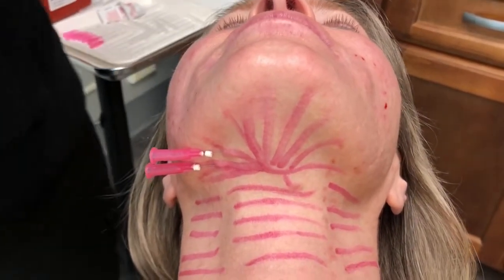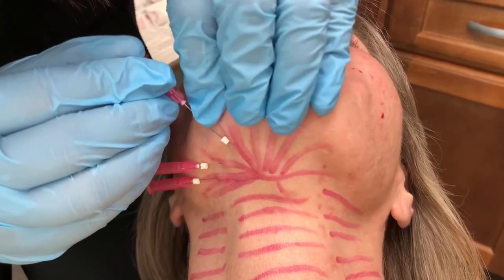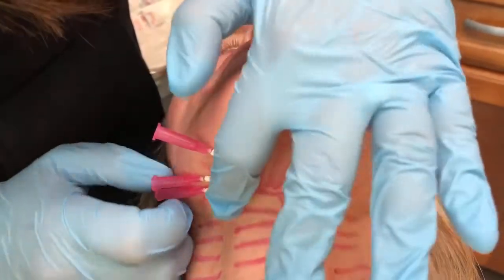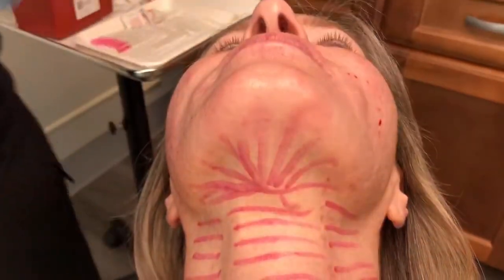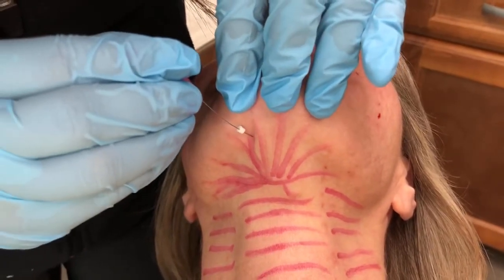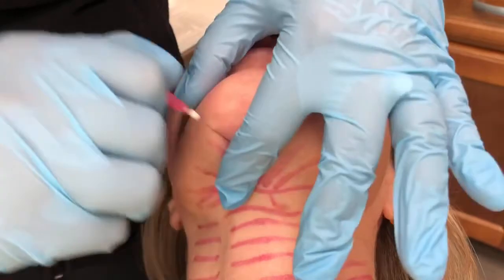The PDO threads that we are using are fantastic. The reason AFE uses a very specific PDO thread is because it produces the most collagen, and that is the choice you should be making as well. It's really important that you use the right PDO thread. You will see other practitioners put in three to four times the number of threads that we will put in for this patient — that means you are using the wrong PDO thread. It's too weak; it doesn't produce enough collagen. You don't need that many if you're using the right PDO thread.